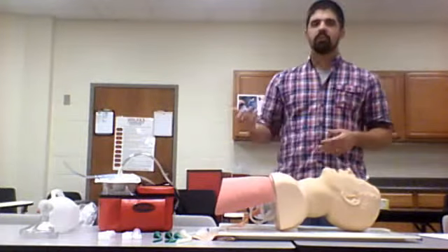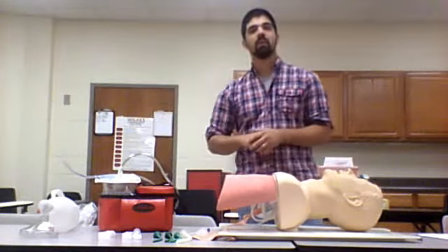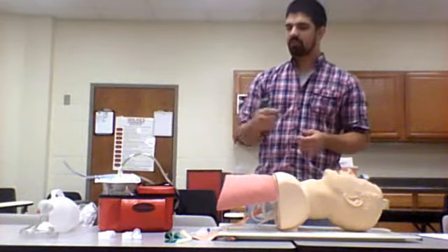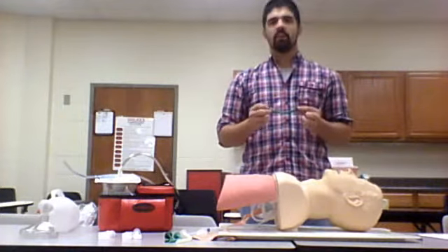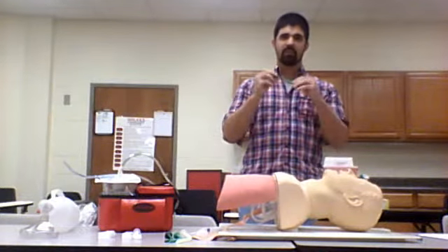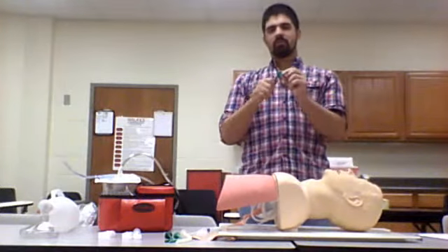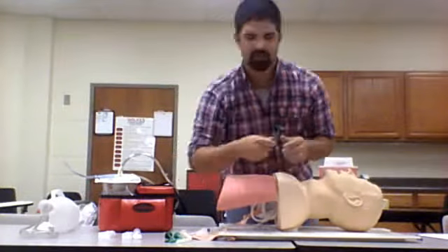So how are we going to do that? Well, we have a few tools to help us out at the basic level to help control this patient's airway. I'm going to go through a couple of them real quick. The first is the NPA. We have a few different sizes here. The NPA is a nasopharyngeal airway. This device is a soft plastic hollow tube, very flexible, just like that. It's got a bevel tip and a trumpet on the other end. Opens up. See that? Right there.